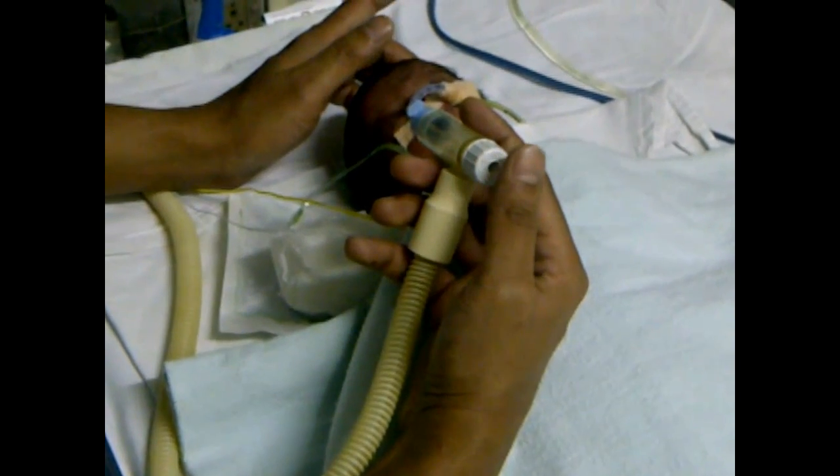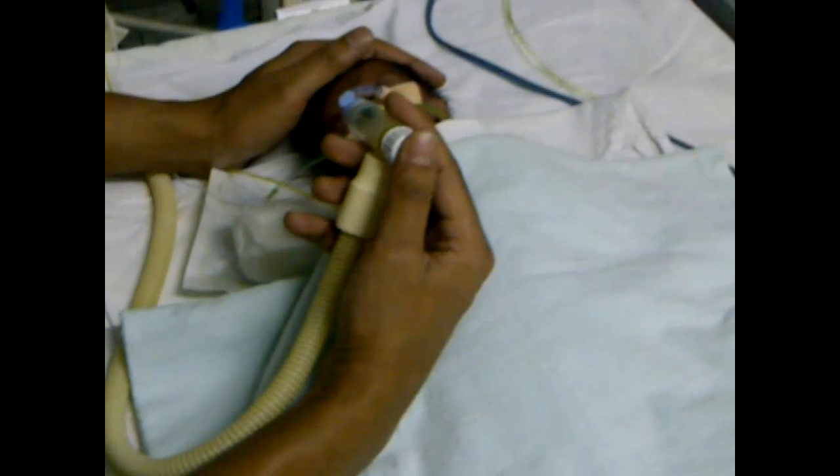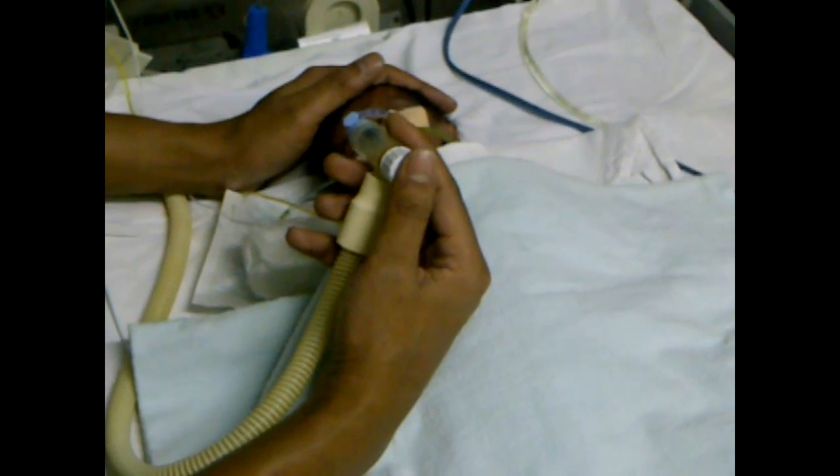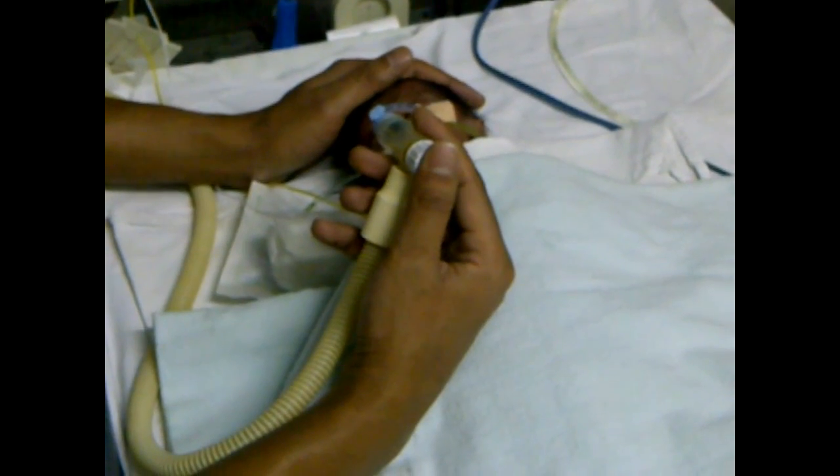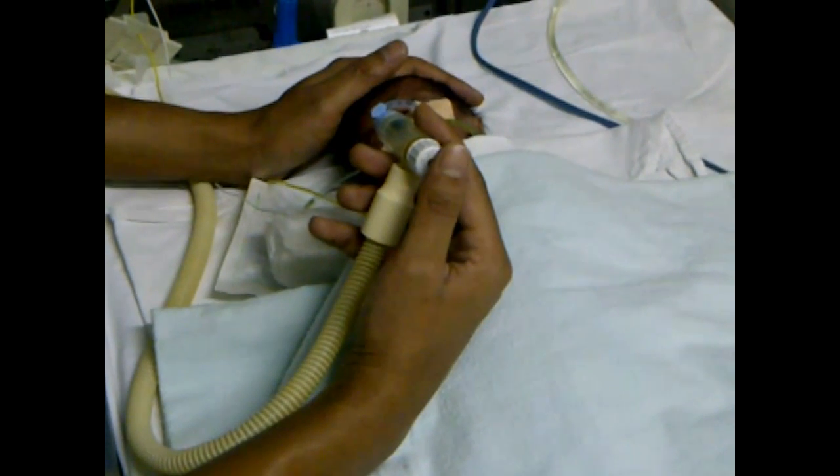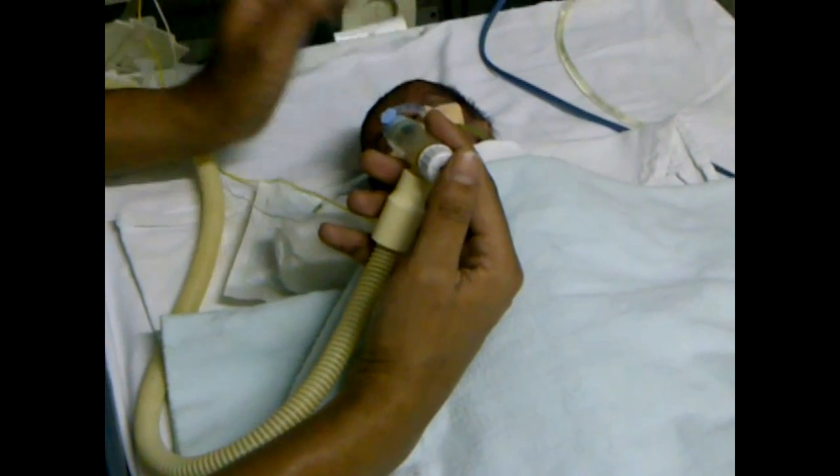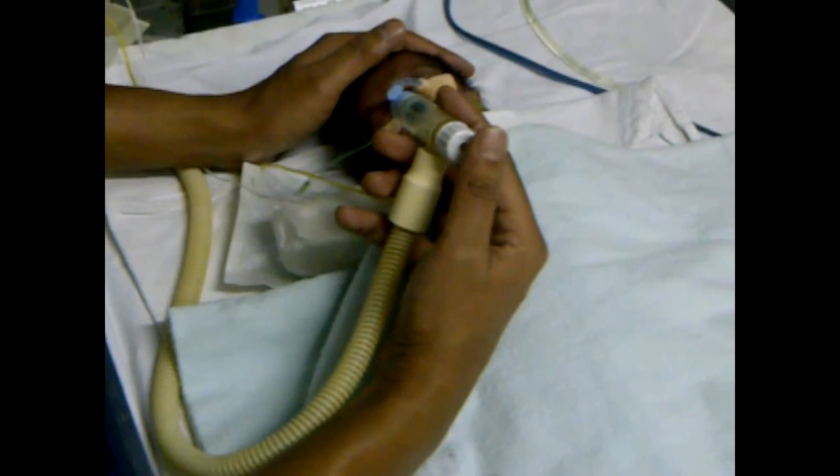By moving the white knob in a clockwise or anticlockwise direction, we can set the positive end expiratory pressure for this patient. All you have to do to deliver a breath is to block the PEEP valve opening with your thumb. You release it and the patient exhales automatically.